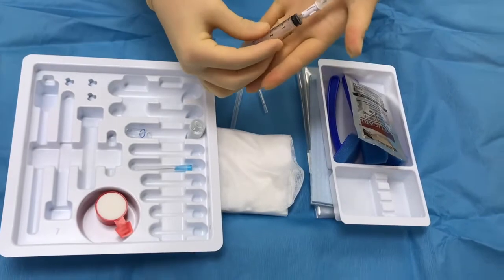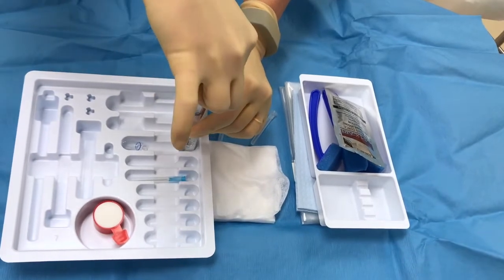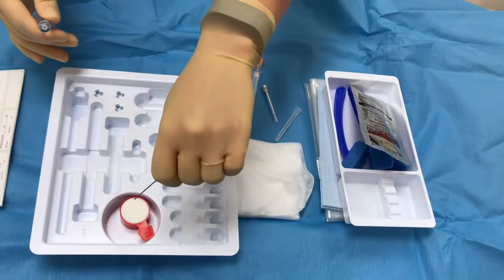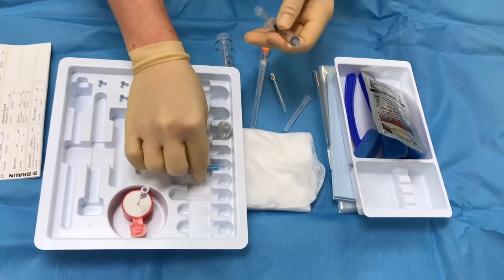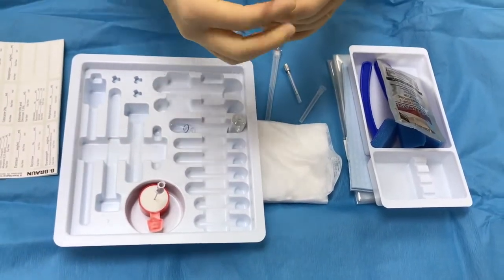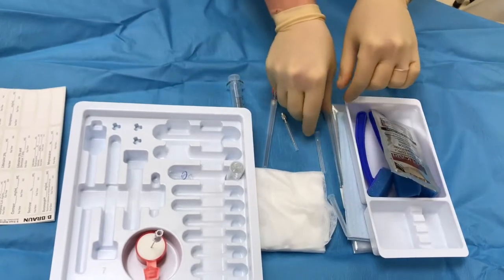And then we have our filter needle on our 3 cc syringe. And then go ahead and I usually just fill it all the way. Anytime you're going to put down a sharp, go ahead and put it in the sharps disposal. And then I attach the blue needle. It's going to be for your lidocaine. It's usually a 25 gauge. And I like to loosen the tip so that it's easily retrievable when it's time.